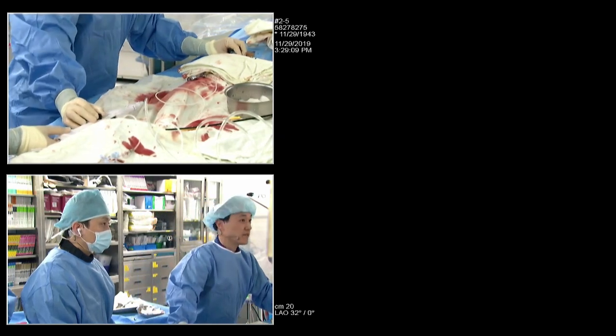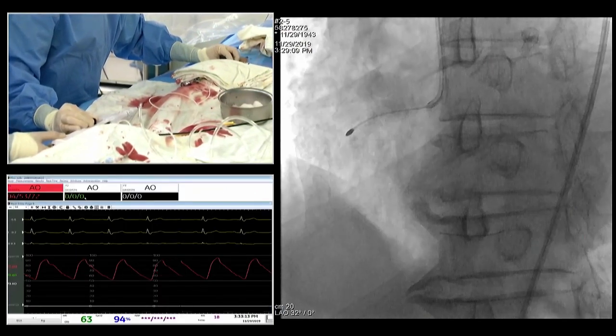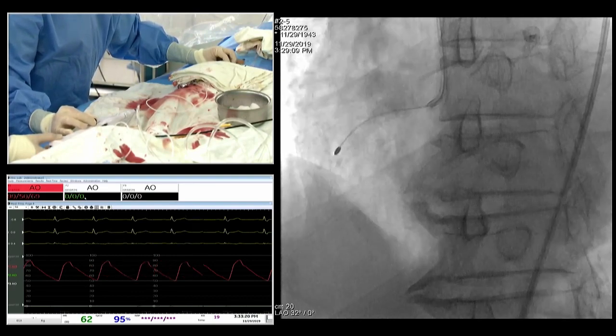Let's try this one more time. I always do flushes. Ready? Yeah, ready. I think it's a good point that it's like adenosine. Exactly. So it's like injecting adenosine at each pass. Okay, we're making progress here.